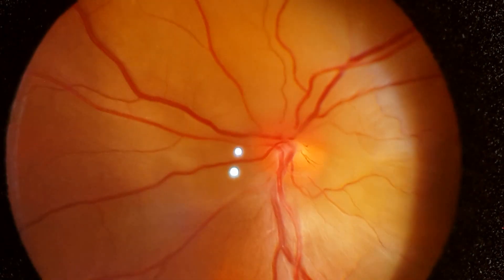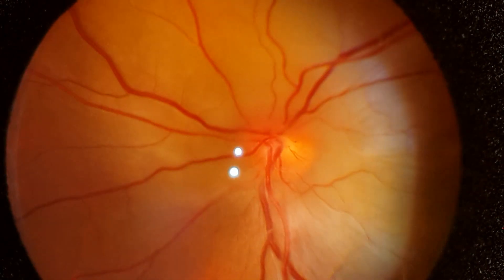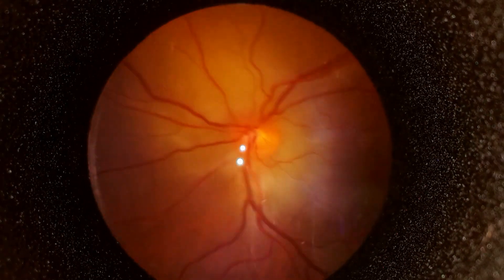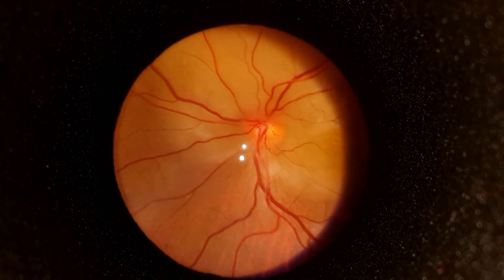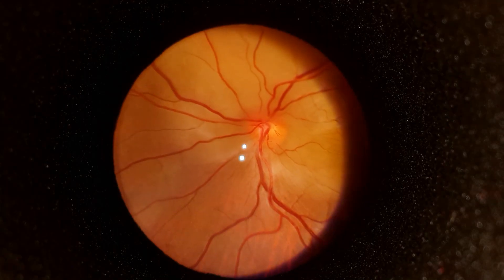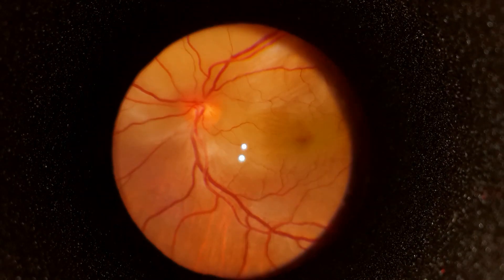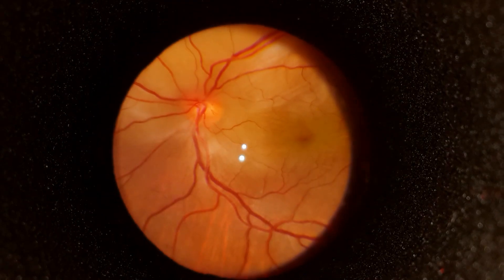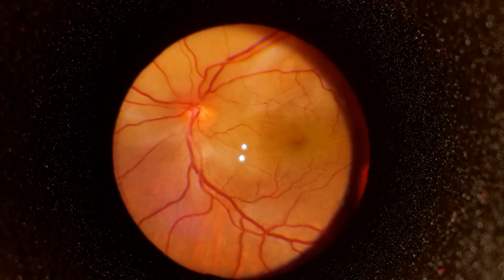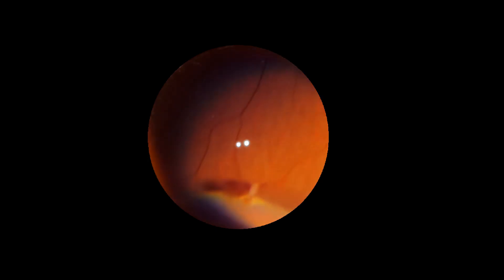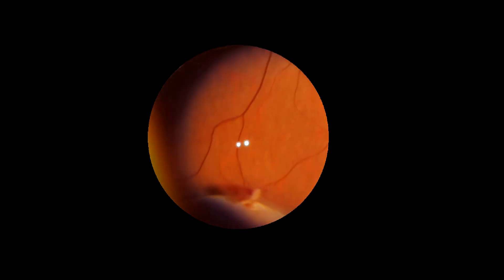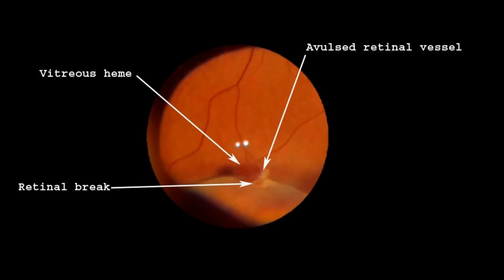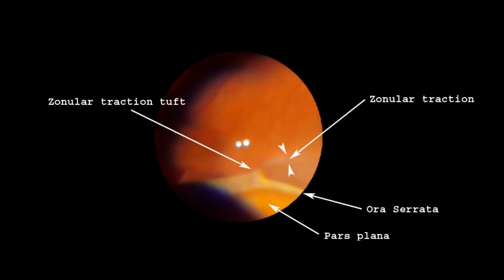As with anterior segment, video documentation is also possible with smartphone fundus imaging. Here is a patient with choroidal metastasis, just superior to the disc. Note the pulsations over the disc and the exudative retinal detachment. This is a patient with avulsed retinal vessel and zonular traction tuft. Peripheral video documentation of such high quality is possible with this cost-effective technique.